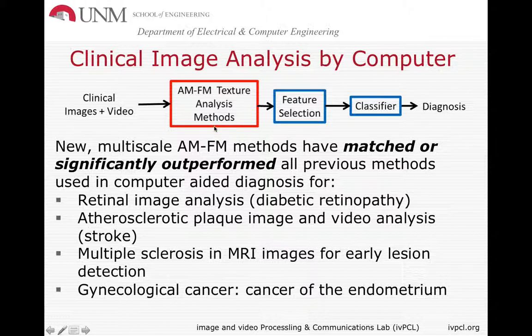He was able to extract information, to encode the image information using what is called AM-FM analysis methods. These are features that the human eye cannot normally see, but they are very useful for the computer. And a computer software called a classifier takes what has been extracted and tries to make a diagnosis out of it.